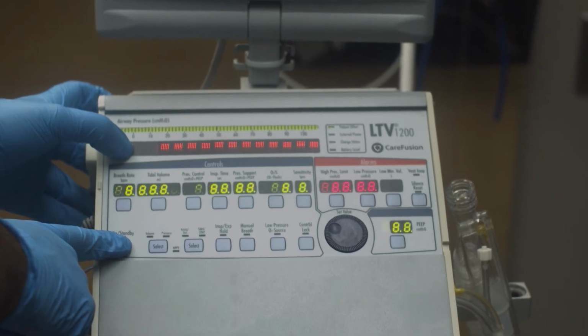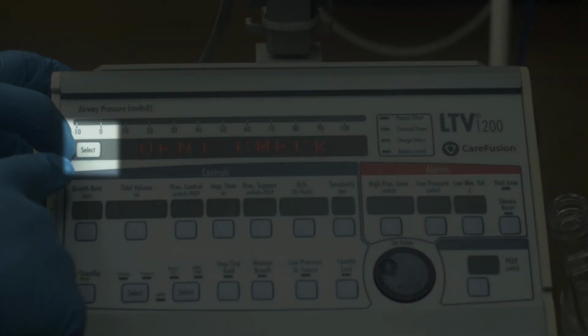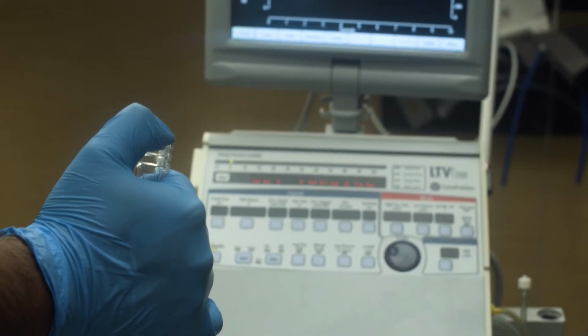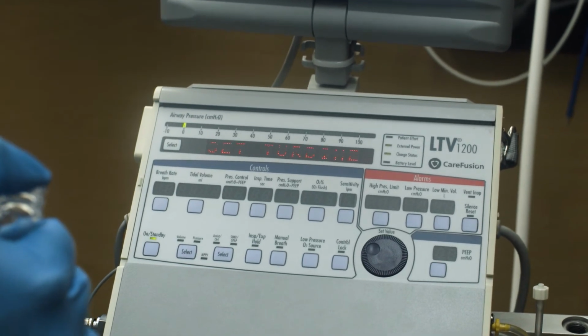The machine will beep. Please take note of the silence button off to the right of the panel, which will be invaluable. Keep pressing select until the screen shows the word leak. Occlude the open end of the main tubing and press select one more time. This will start the test, which takes roughly 20 seconds.